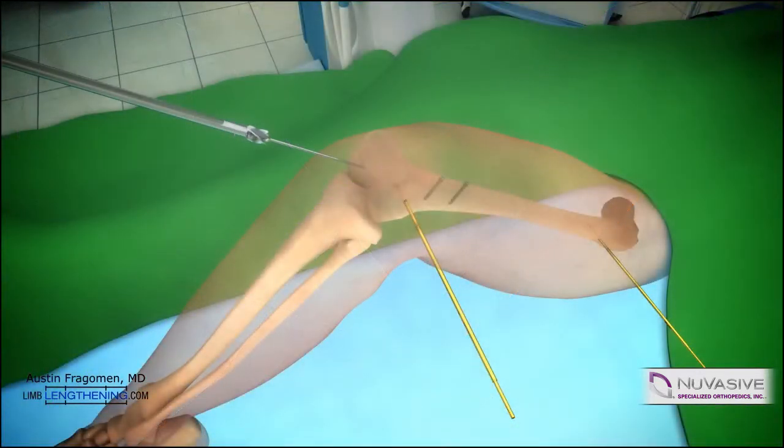The knee is then flexed and the entry point is found. A rigid reamer can be inserted just lateral to the blocking screws to start the path of the nail.